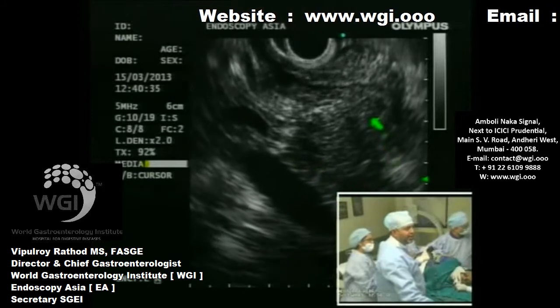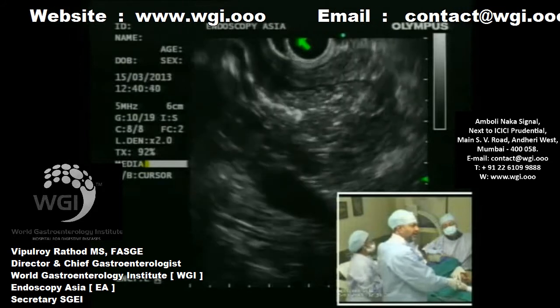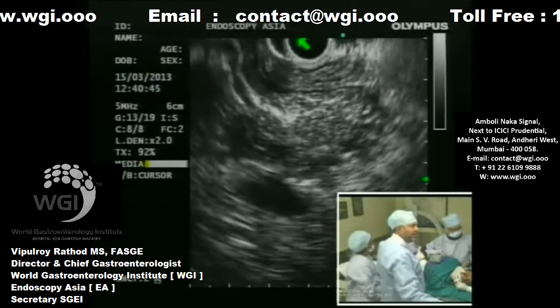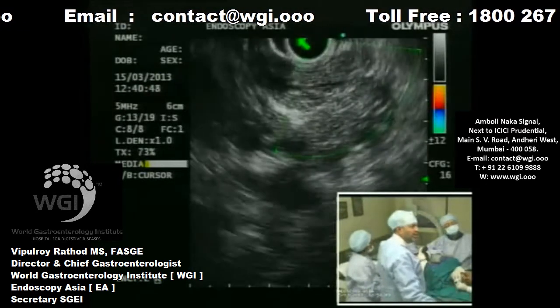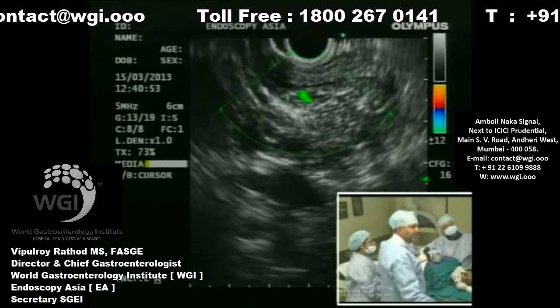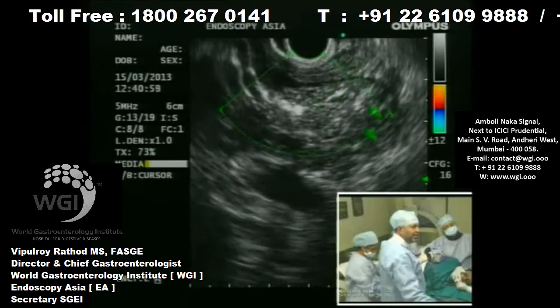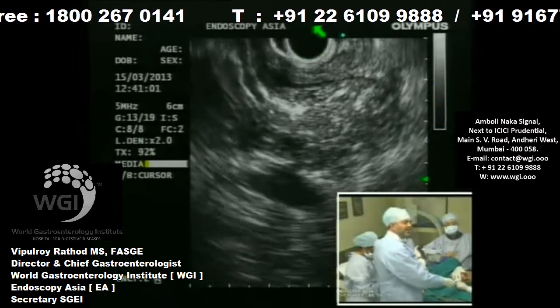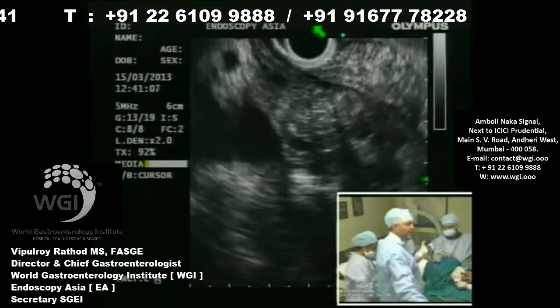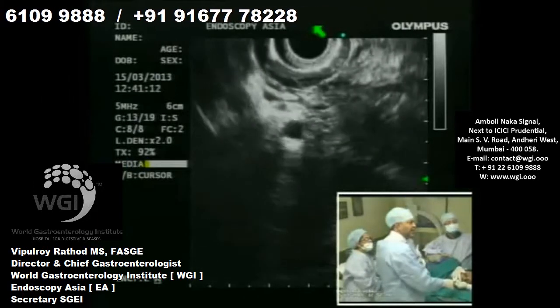You can see this is the whole pancreatic head here. And I'm seeing the bile duct also running inside. I'll show you. This is the bile duct which is getting squashed. Look at that. I'll show you the bile duct with the cursor. This is the CBD getting squashed here in the pancreatic head area. So that is one thing which I've seen, a very, very bulky pancreatic head. You can see a hypoechoic pancreatic head with a slightly prominent bile duct, I think. Let us see.